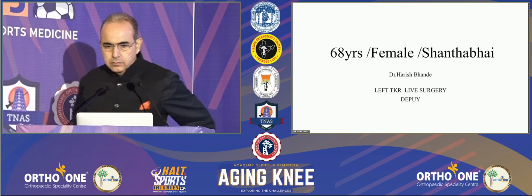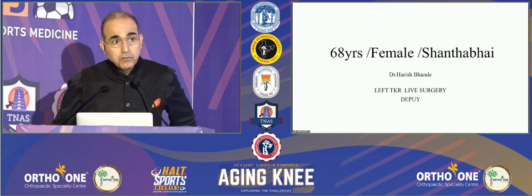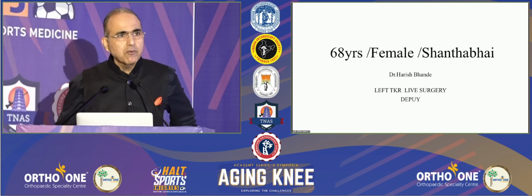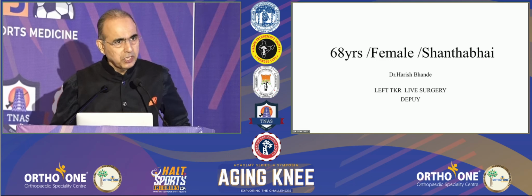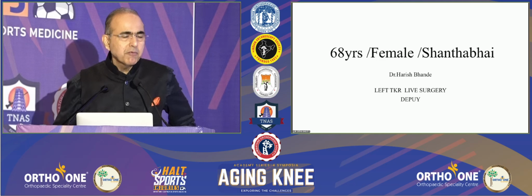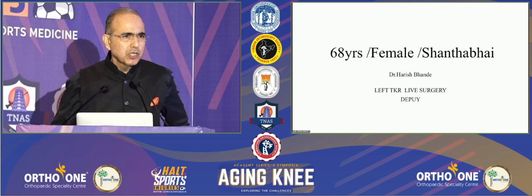Limit of the pre-arthritic varus? Or the limits of the cuts? Limits of the cut. Usually we start with 3 degrees, and the maximum we have gone up to is 6 degrees of varus on the tibia, but that's very rare. 85% of cases can be handled by about 3 degrees varus, maybe 5% by another 1.5 degrees. That usually gives a very good extension balance.